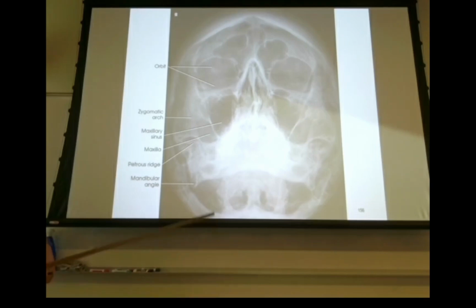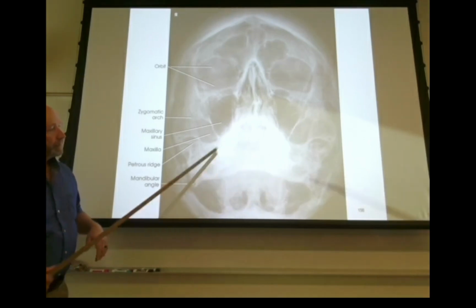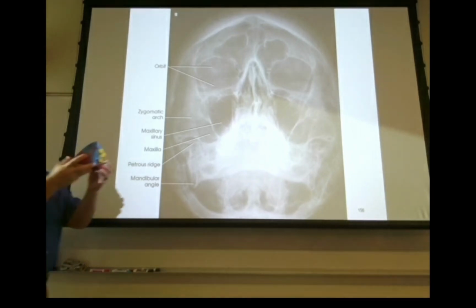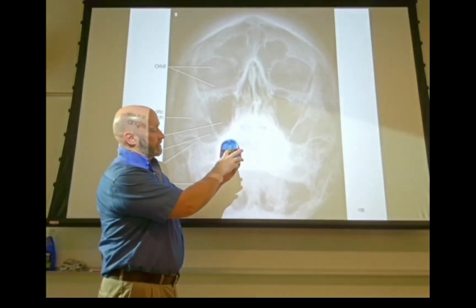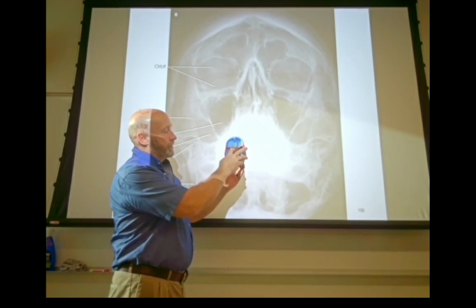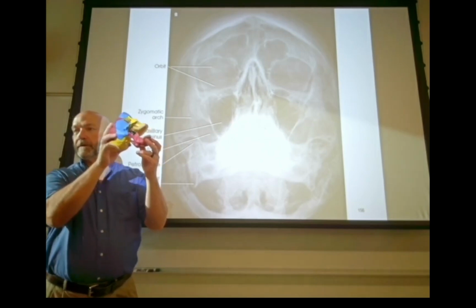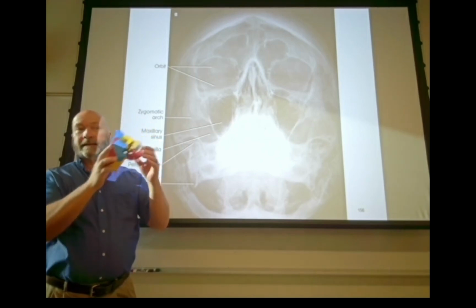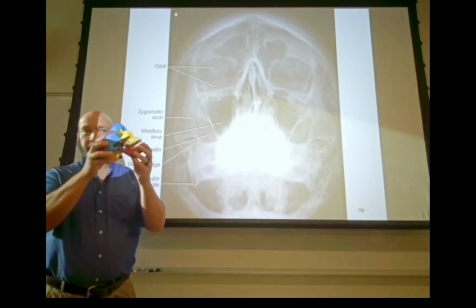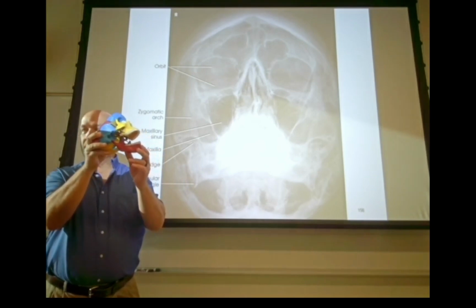All right, so what is this? It's an odontoid process, right? So if you were to come directly up from this, well, you got the mandible coming across here. But if we were to take that patient in the 37 Waters, our sphenoid sinuses right there, if I were to open the patient's mouth, where would that sinus be projected? Right in the middle of the open mouth. Right. So we can see all four sinuses with just this one positioning, right? There is a 37 Waters for sinuses, and there's also a 37 Waters with the open mouth.